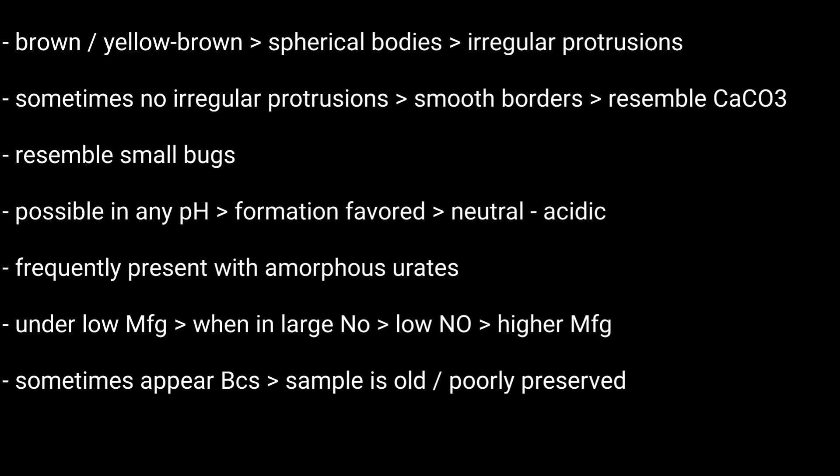Sometimes ammonium urate crystals only appear because the urine sample is old or has been poorly preserved. Because of this, recollecting a urine sample may be advised if these crystals appear.